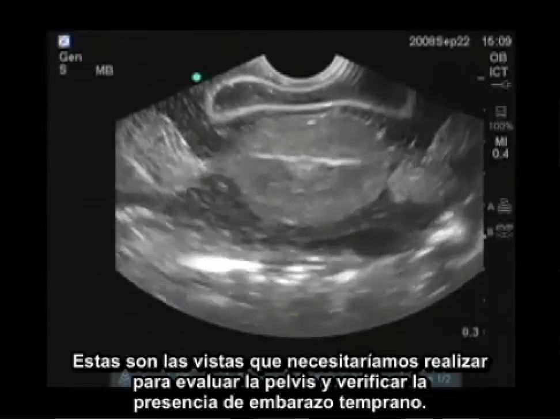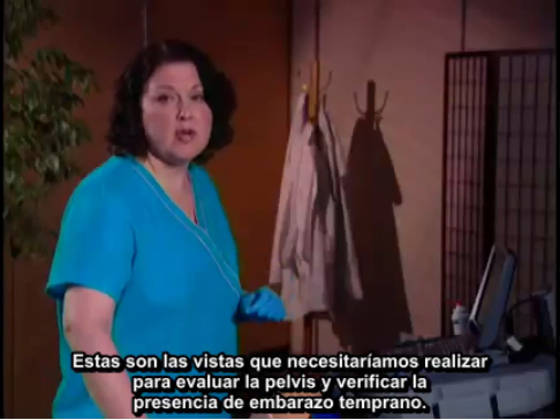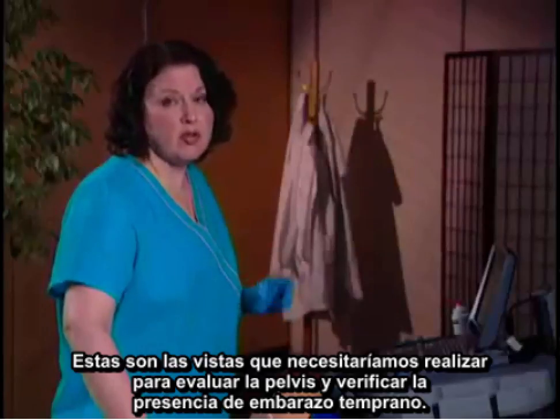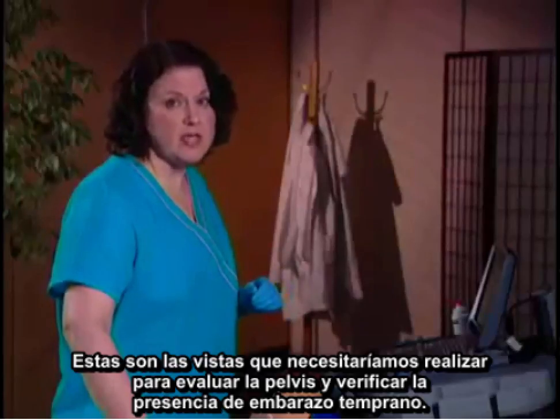So those are the views that you would need to do a thorough assessment of the pelvis for early pregnancy.